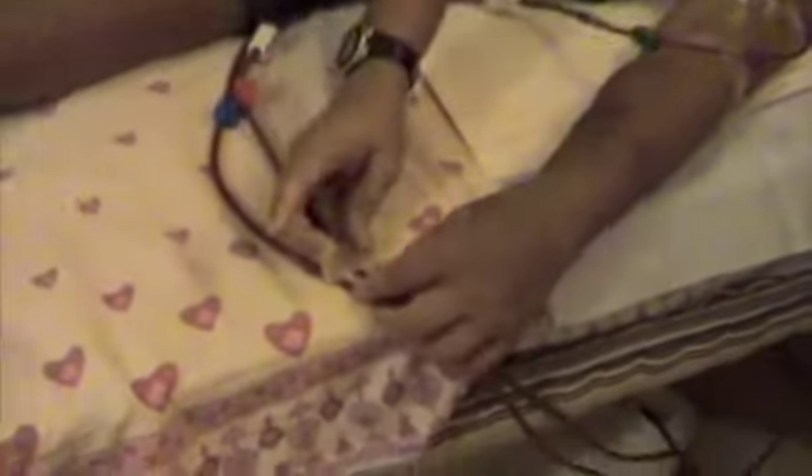I need to tape these tubes so that any pulling doesn't cause the needles to come out — any jerk that might be there will be arrested here itself. Then I tie this string around my finger and put this tape here so that I don't move my hand too much.